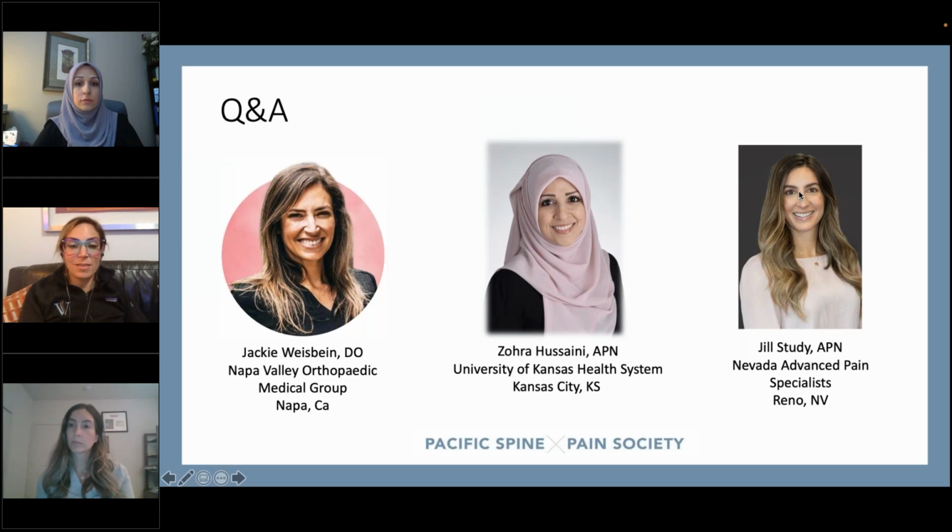I'll be perfectly honest. The answer, in my opinion, is yes. When I talk about stenosis, there was a slide of some Vertiflex that I did for a patient who had a stim placed before her stenosis got symptomatic. I think about stenosis in a lot of these patients as something that is mechanically compromising the nerve's ability to transmit energy, right? It's being compressed. If it's not able to transmit that energy and power, which is why patients have that heaviness sensation or the painful sensations, then it's possible that spinal cord stimulation could absolutely fail over time.